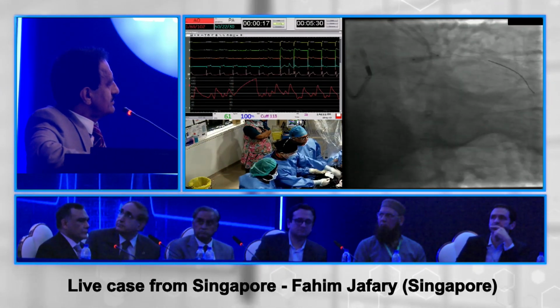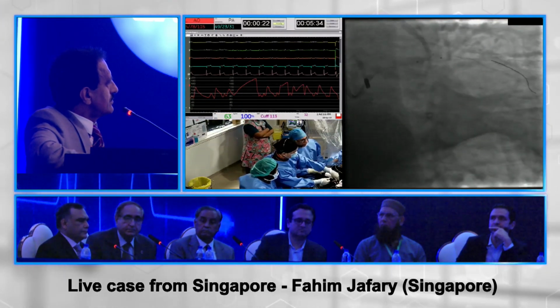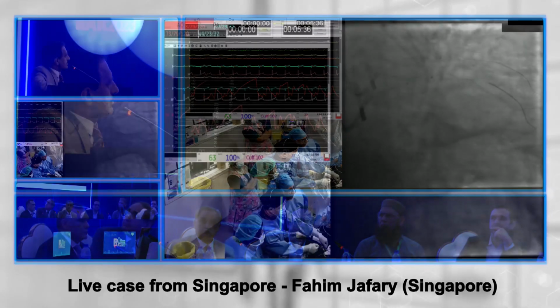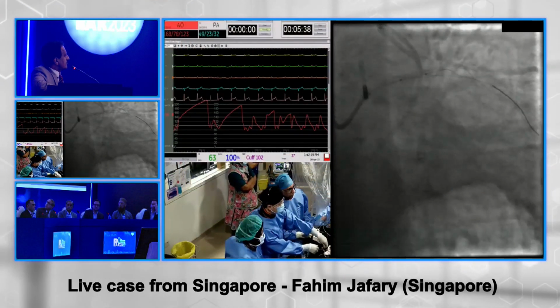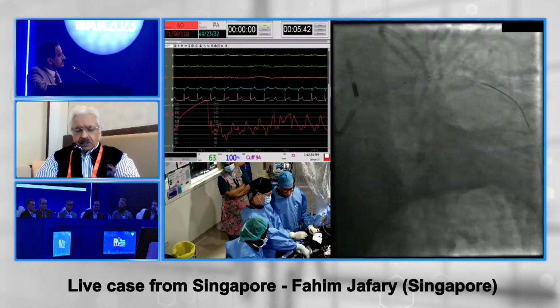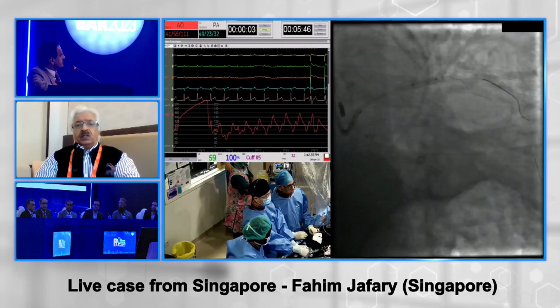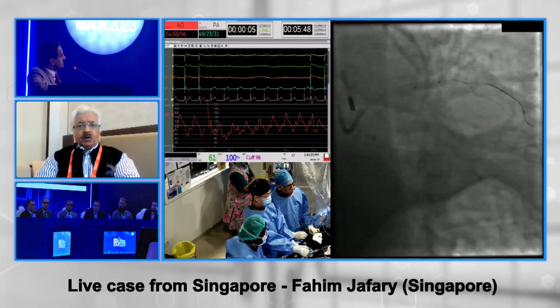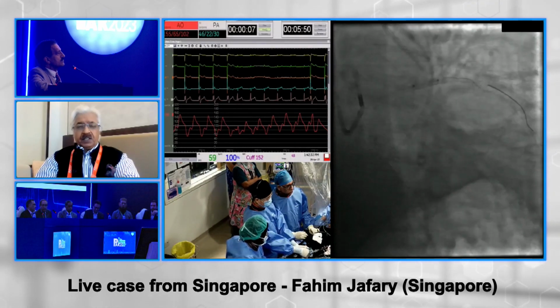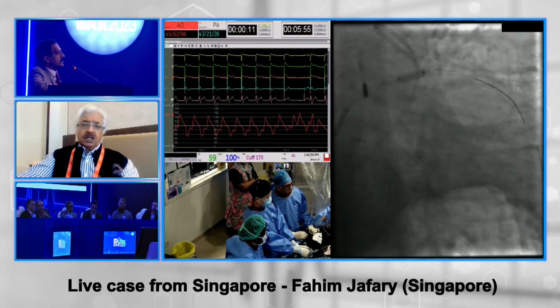No, not in calcium, but in other circumstances, yes, within a stent or in-stent restenosis. But the Wolverine overcomes that very well because I think the blades go really well within, and therefore with the Wolverine we've never faced problems like this. But in my experience of many years, I have had blades getting stuck in other situations.